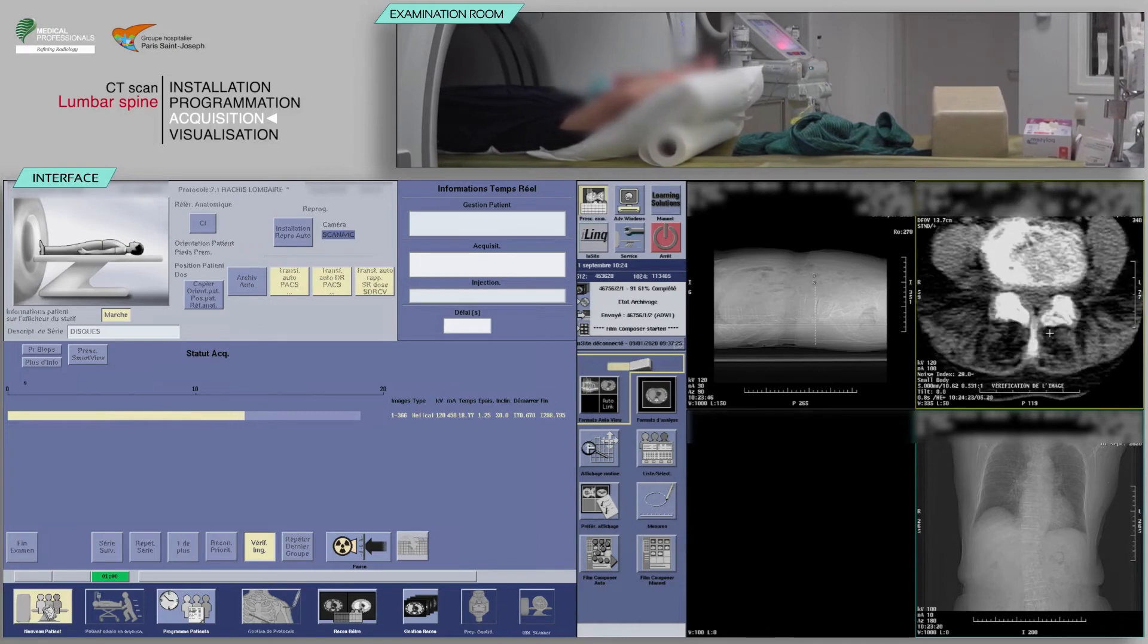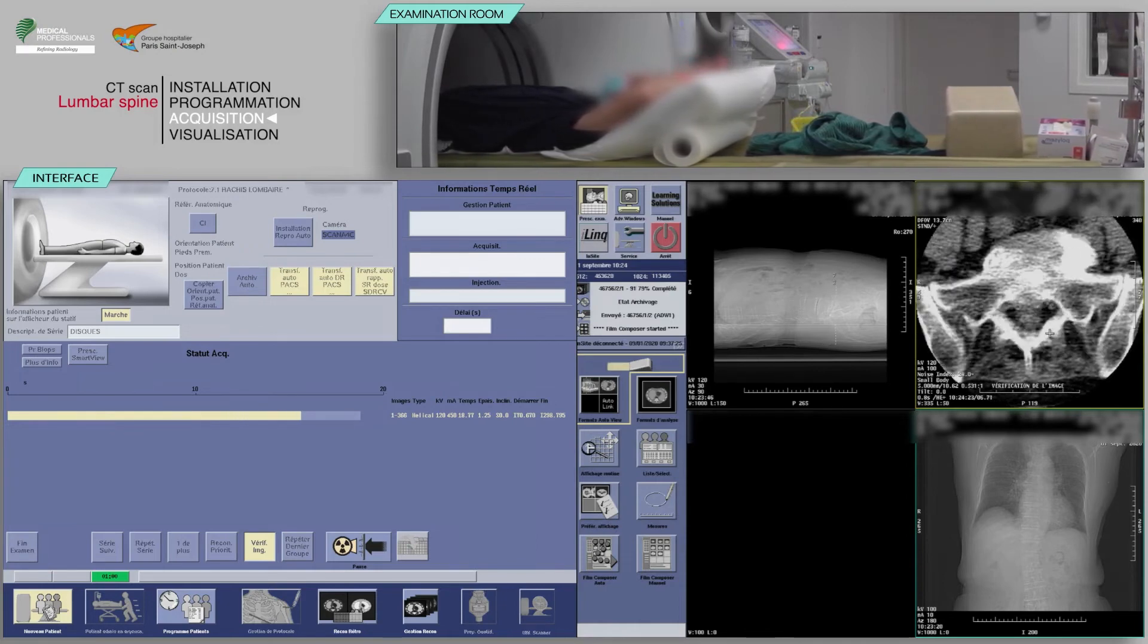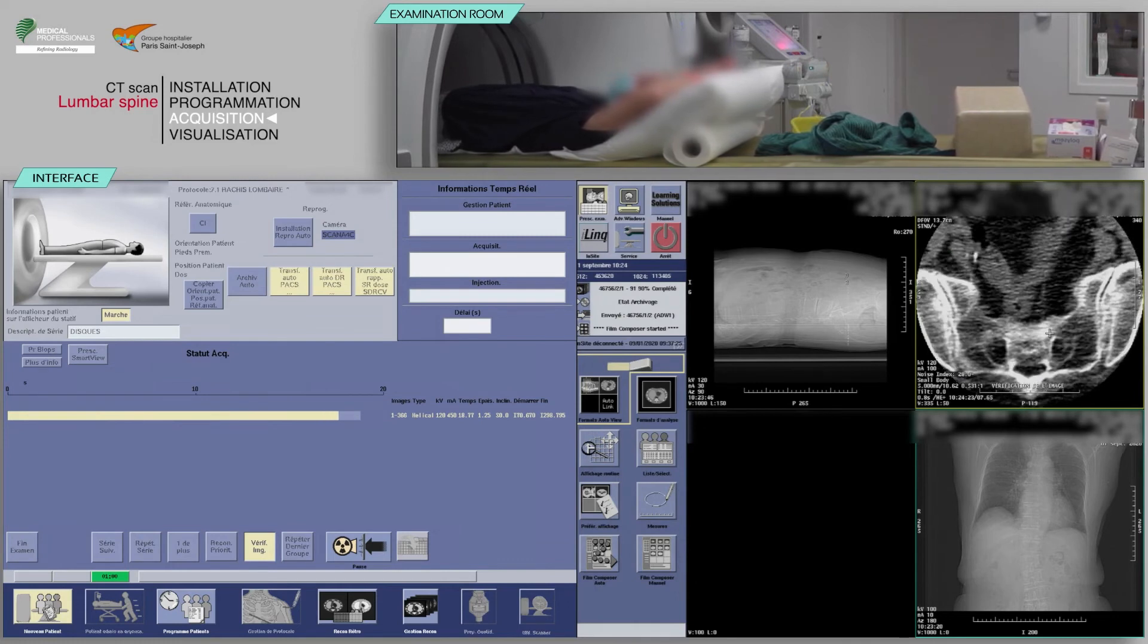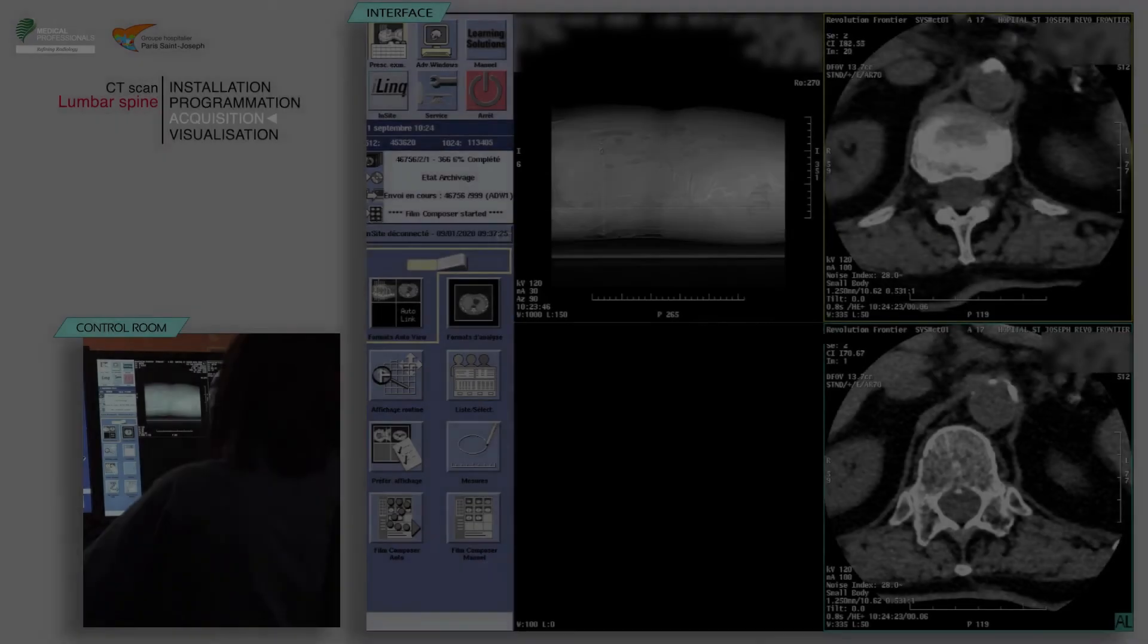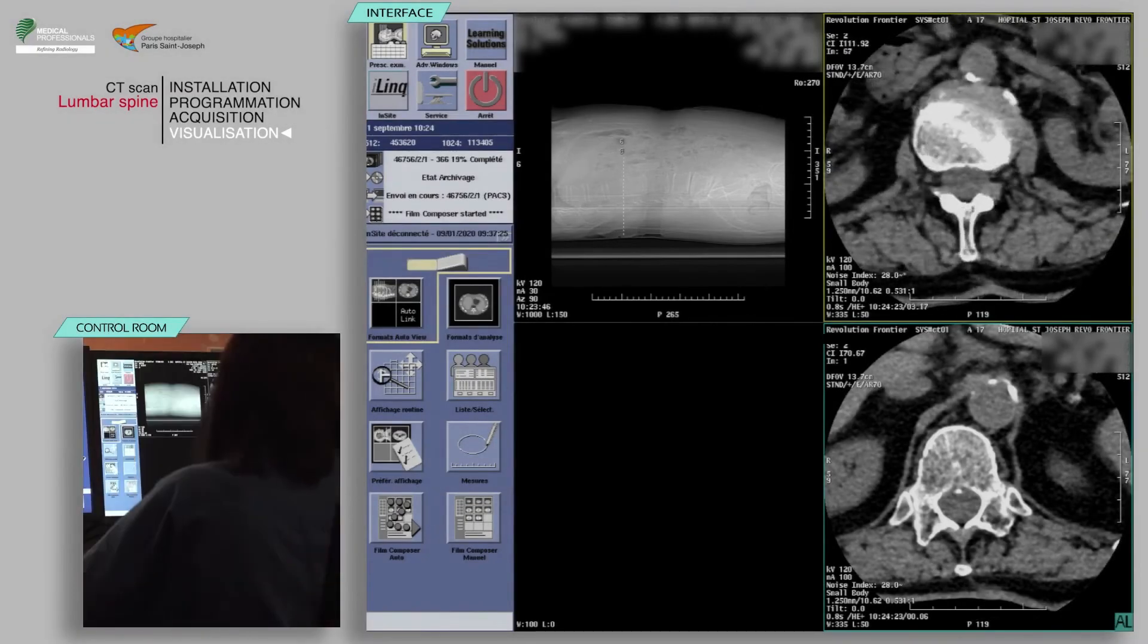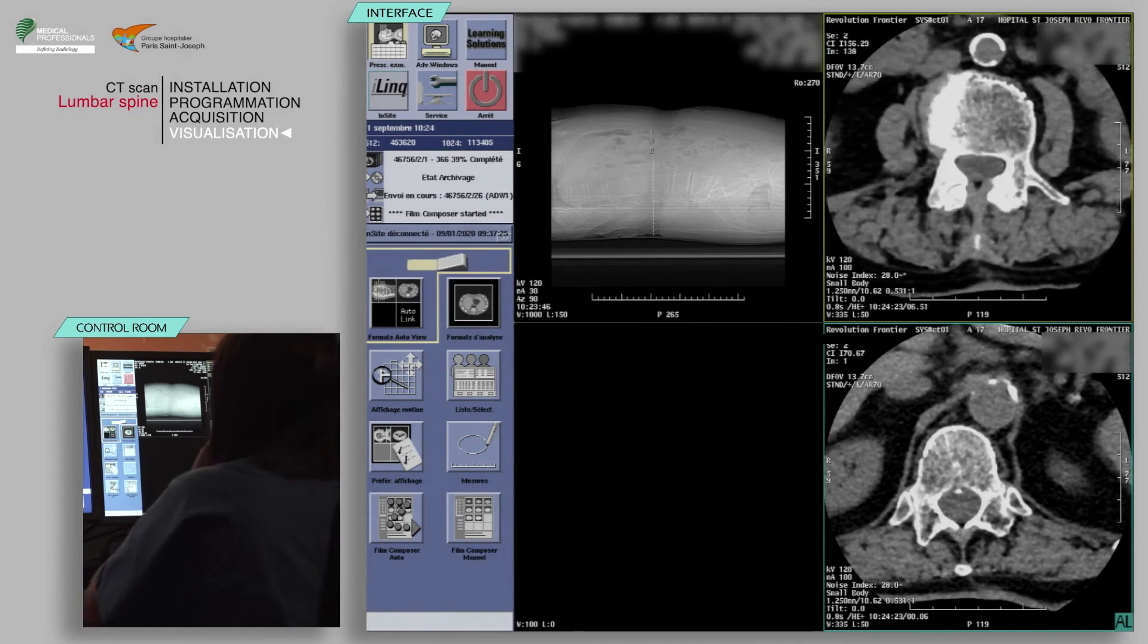Verify the absence of patient motion on the acquisition and ensure that all anatomical structures are covered. After clicking End Exam, you can now perform MPR and eventually a 3D volume-rendered reconstruction.